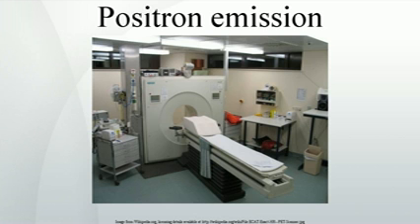These are detected when they reach a scintillator in the scanning device, creating a burst of light which is detected by photomultiplier tubes or silicon avalanche photodiodes, Si APD. The technique depends on simultaneous or coincident detection of the pair of photons moving in approximately opposite directions. It would be exactly opposite in their center of mass frame, but the scanner has no way to know this, and so has a built-in slight direction error tolerance. Photons that do not arrive in temporal pairs, that is within a timing window of a few nanoseconds, are ignored.